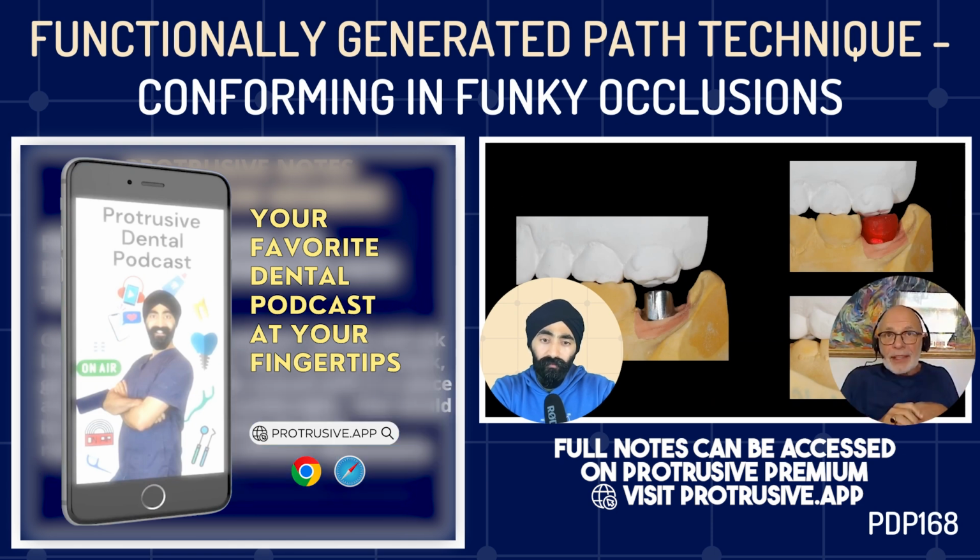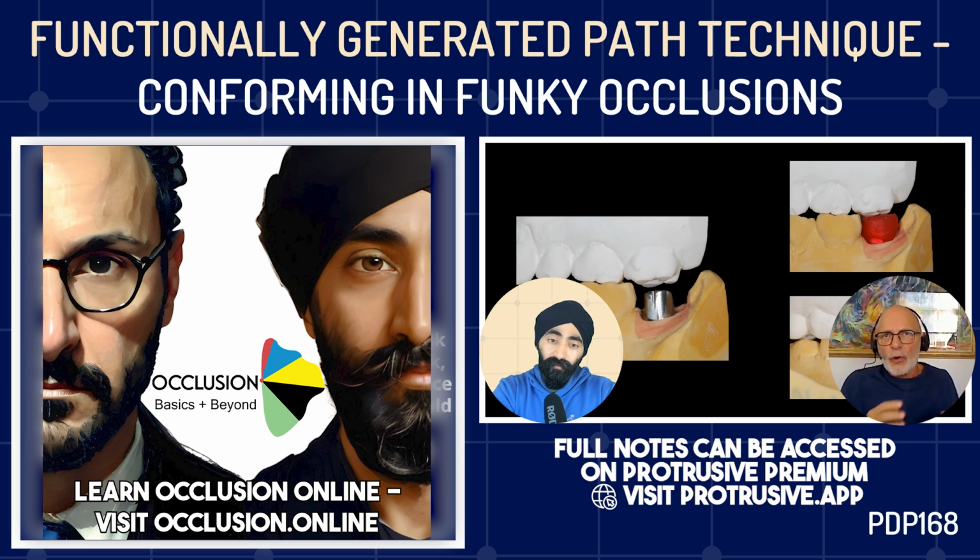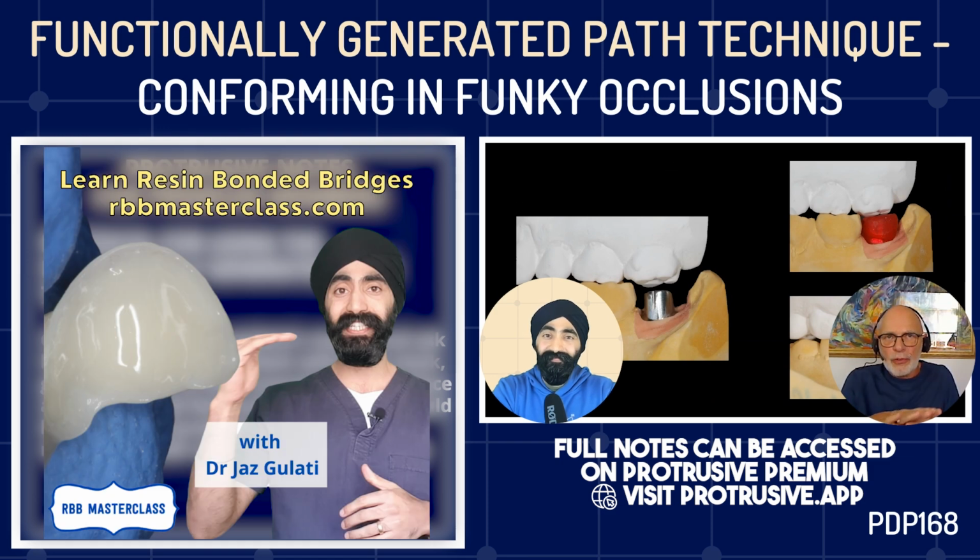And then you can put it back in the mouth and check and test. You say to the patient, how does that feel? Yeah, I can tap my teeth together. That's fine. You can check the shim stock, check your holds, and then you can get the patient to slide around with it in place. And they should feel complete freedom. They will be used to their own particular movements, and each patient's different in these malocclusions where you have posterior guidance. They'll just be able to slide, and you say, is that comfortable?